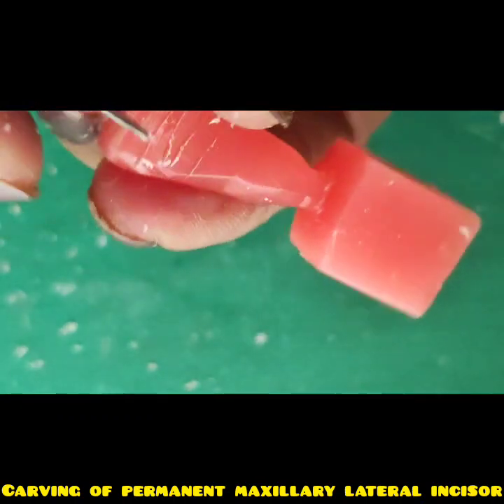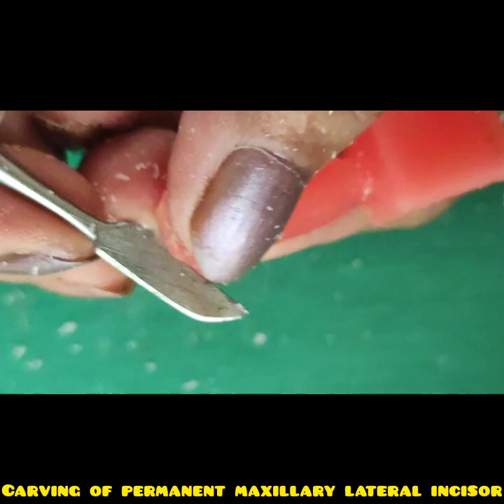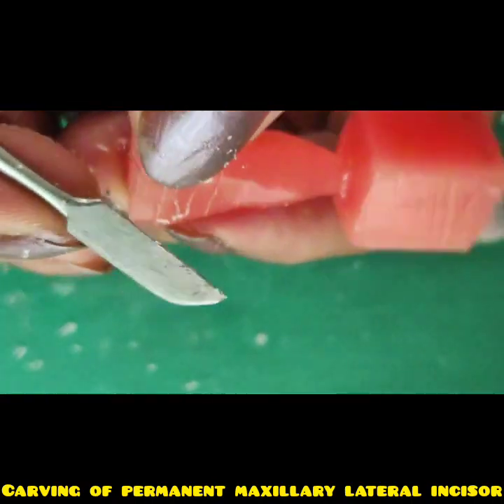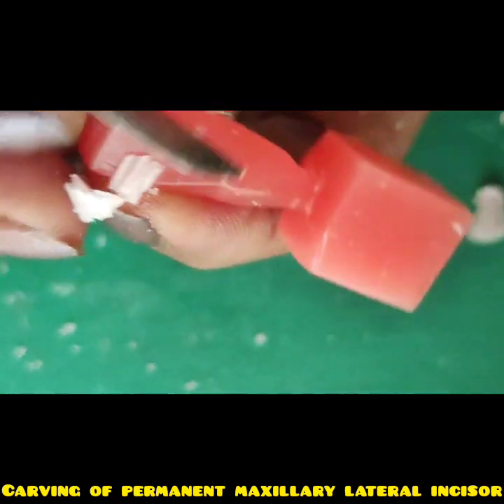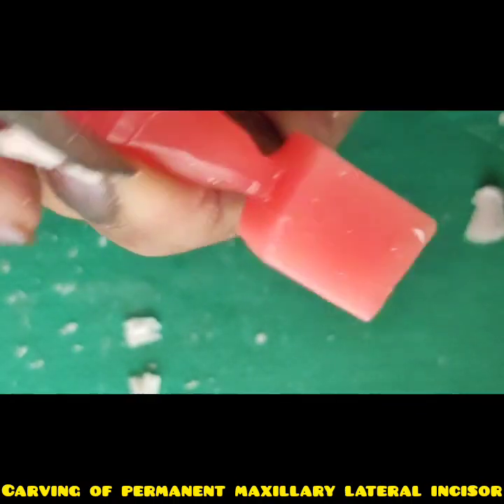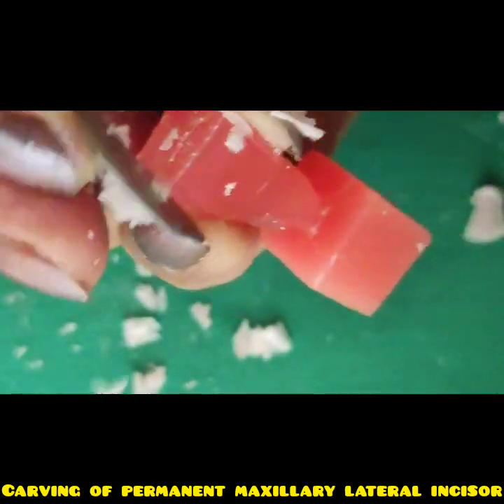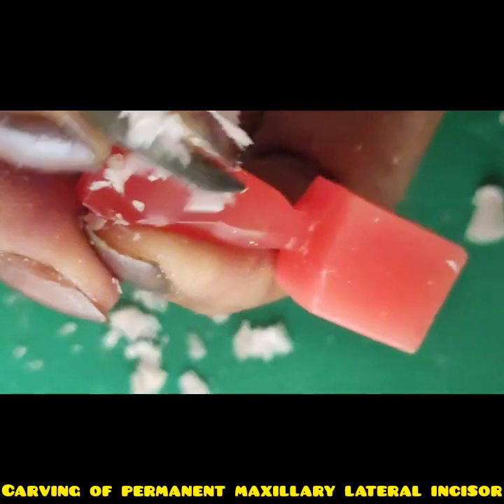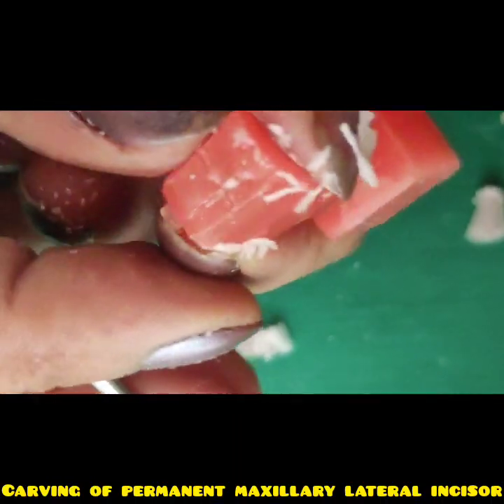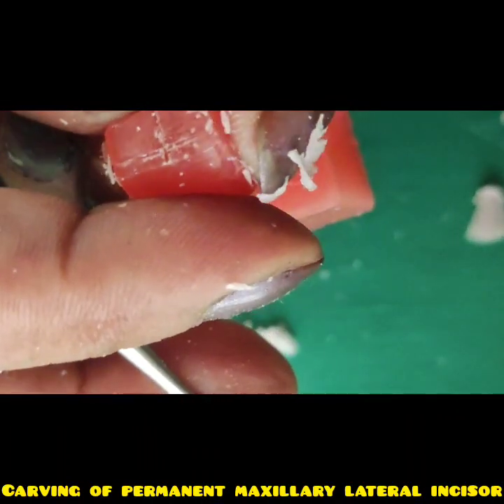So similarly, like the central incisor, keep your carver at an angle, the straight edge, and reduce till you reach the center on top, like this, so a little more, like this.